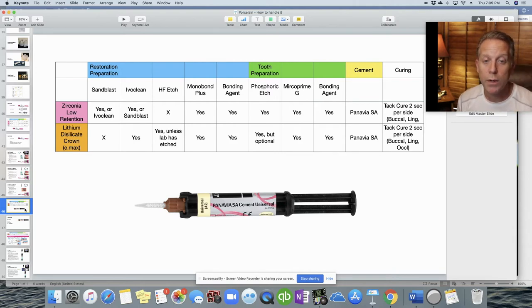The steps differ depending on the material: do not sandblast Emax, but you can sandblast zirconia. Use IvoClean on Emax. Etch the internal surface of Emax with hydrofluoric acid — but do not etch zirconia internally. Apply Monobond Plus in both situations, then paint on the bonding agent. For the tooth, etch with phosphoric acid, apply desensitizer, and use the bonding agent. If etching risks bleeding in the field, you can bypass the etch step when using ClearFil Universal Bond Quick. Then mix the Panavia SA and place the crown. Tack cure is only two seconds here — it sets much faster.